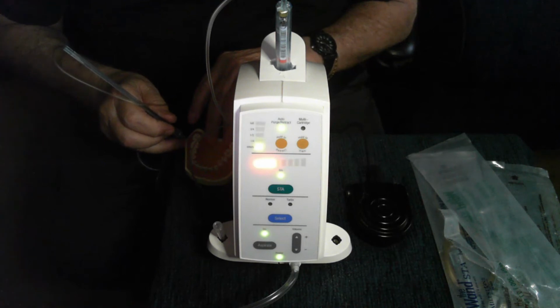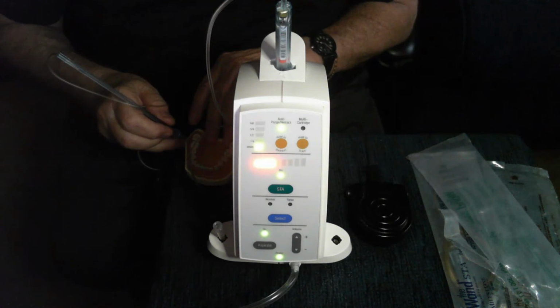You just heard 3/4 of the cartridge being dispensed. We don't necessarily want it to go to green because that means that we're probably putting too much pressure on the needle, which will block the flow of the anesthetic and keep the anesthetic from dripping into the bone where we want it to go, which will give us satisfactory anesthesia. Whenever we see the lights come on and we hear that sound, then we just hold the needle in place.